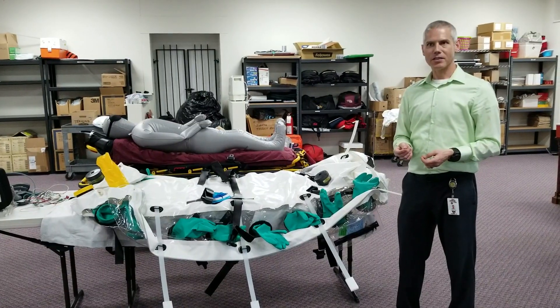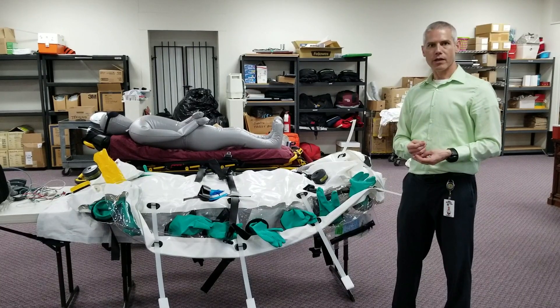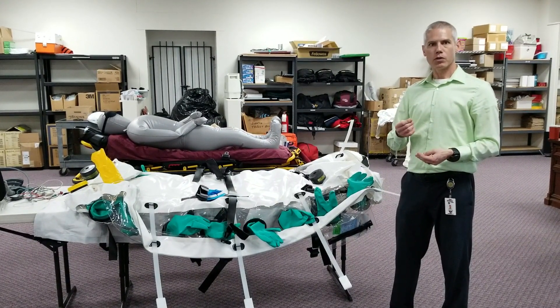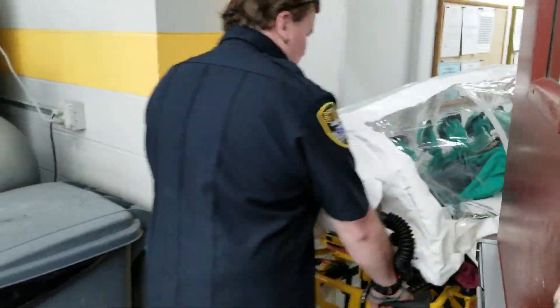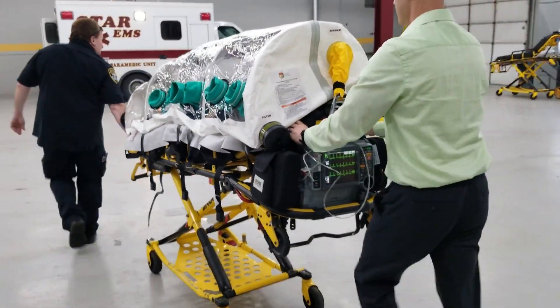Our training is in partnership with St. Joe's Mercy Hospital Oakland, which is one of the handful of hospitals in Michigan rated to receive and treat a patient with a highly infectious disease such as Ebola. They are also supplied with their own isopod like this one.